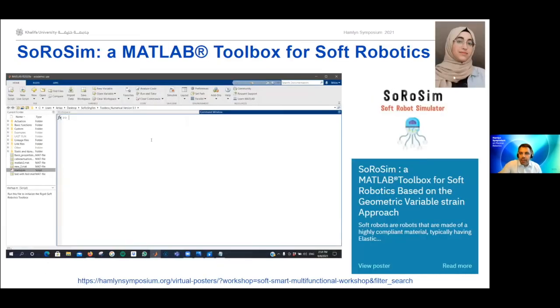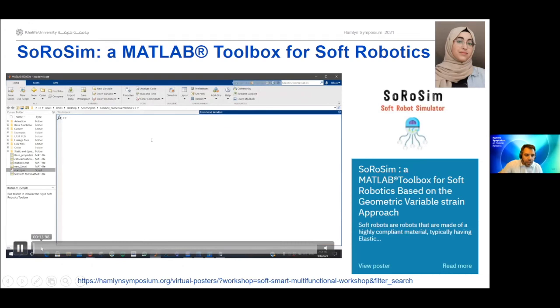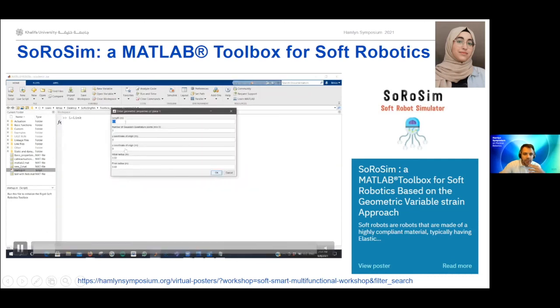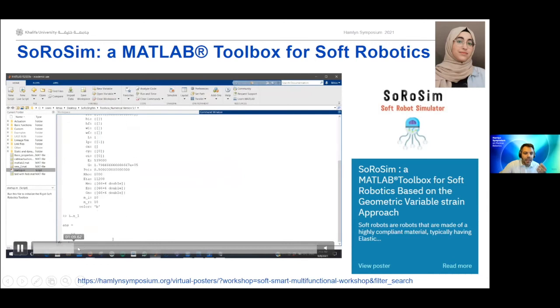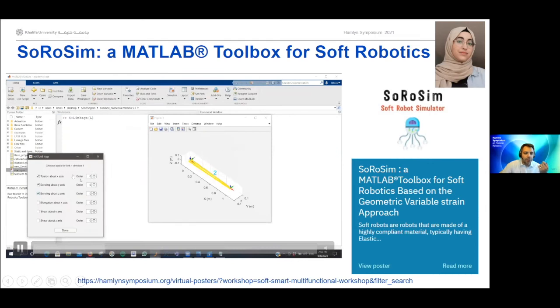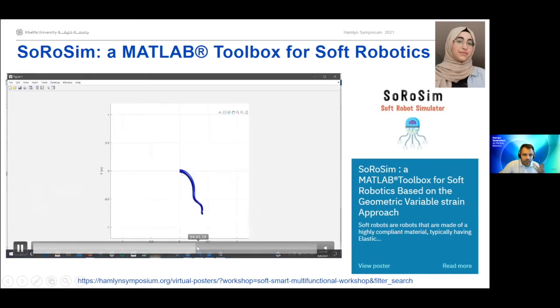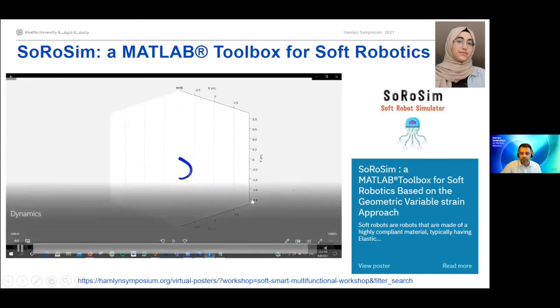Finally, my student prepared a tutorial for the poster session. We actually developed a Matlab toolbox out of this approach, and you can find a small tutorial there where the student will show you how to set up the parameters of the link, how to build a linkage, and how to select, for instance, the order of your bending and torsion and whatever degrees of freedom you want to activate here. And then several things: static analysis, dynamic analysis, etc. You can head to the poster session to see more.